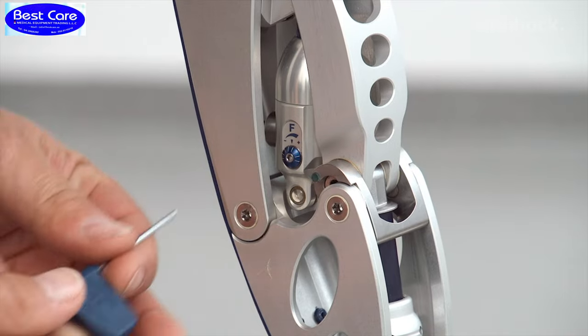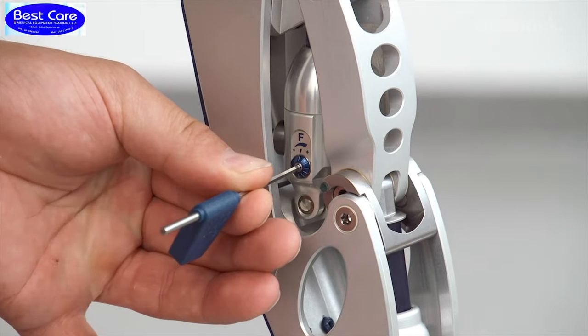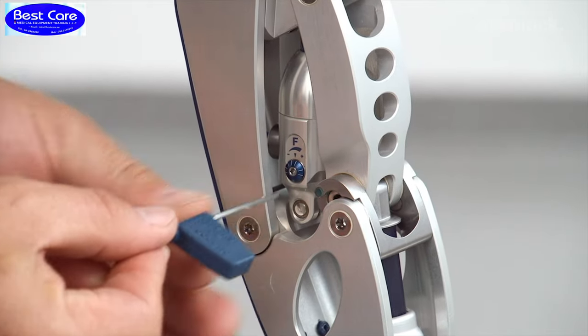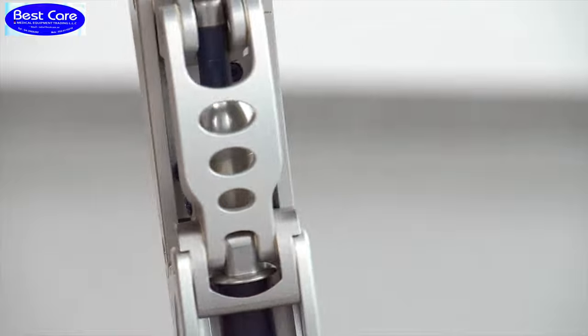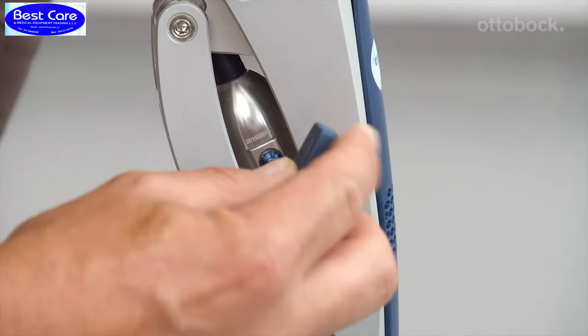Please check the factory settings before fitting the user. The default factory setting is set to minimum for the extension and to medium for the flexion damping. The EBS unit is set to provide low resistance.